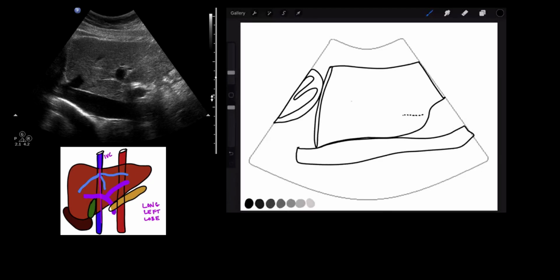Posterior to the liver then is the IVC, which is typically a flexible tube with variability that goes along with the patient's breathing. And we can also see a hepatic vein emptying into the IVC. The variability of the shape and the hepatic veins emptying into it is proof that we are definitely looking at the IVC. Labeling our image again, we have the heart, followed by the diaphragm just inferior to it, and the left lobe of the liver.